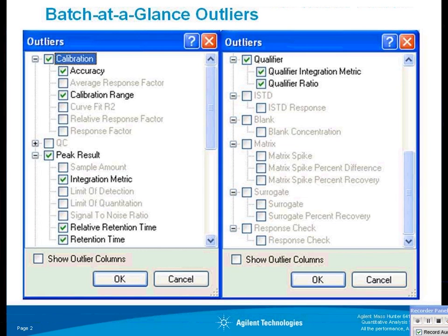In the results section, we have several outliers, including the integration metric, which we have talked about in the integrator section. Also, the integrator metric is applied to the qualifier. Another section that's turned on by default is retention time. So we tell you if the peak is wandering from the expected retention time or the expected relative retention time from the ISTD. And last, the qualifier ratio is an outlier which is turned on by default.